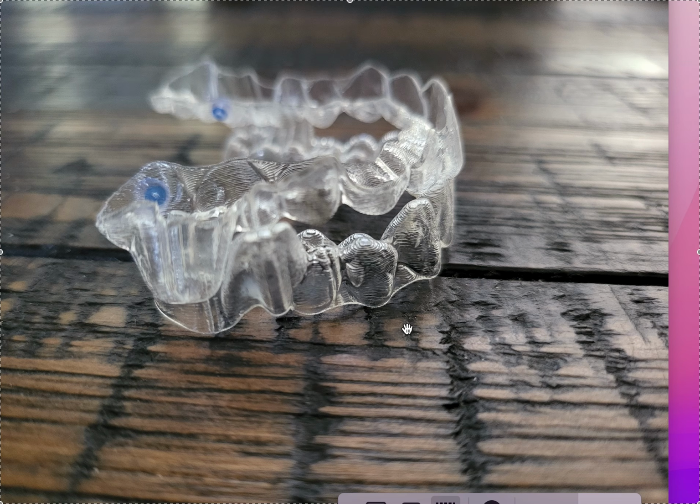So Invisalign with MA comes in two different products, okay? Depending on what country you're from, there's different menus of options that you can purchase from Invisalign. Everyone has Invisalign Comprehensive. That's available in every country. And you can get Invisalign with MA with Invisalign Comprehensive. I don't know if you can get it in every country.